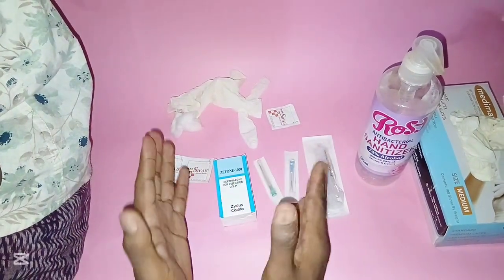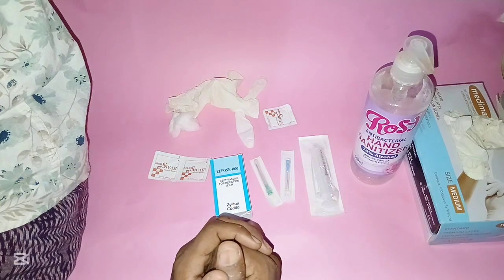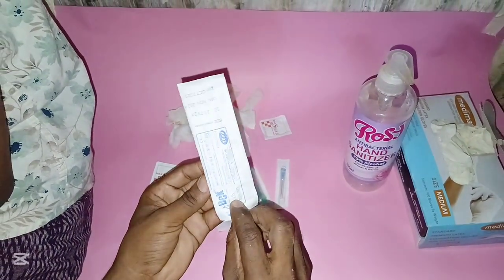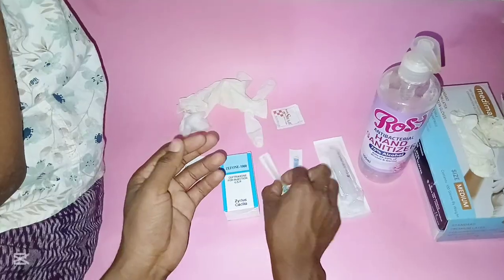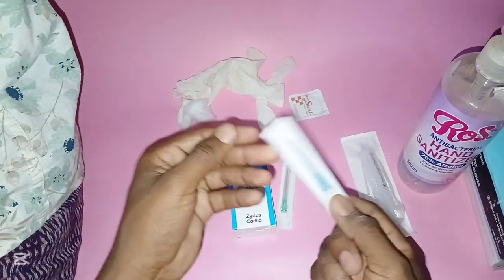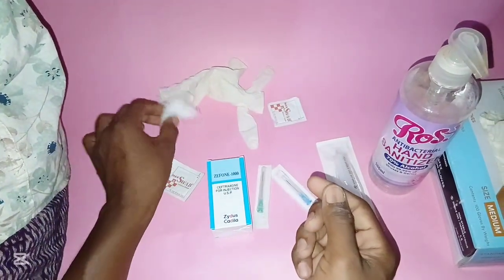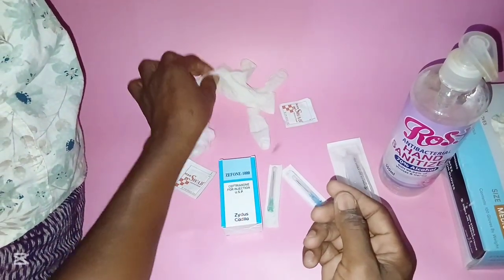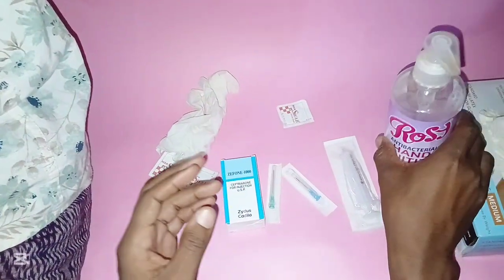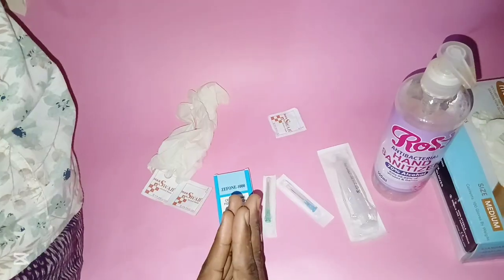Before you start, make sure you gather all the necessary supplies that you need to perform the procedure. For instance, you will need a 10 ml syringe, a 21 gauge needle or a 23 gauge needle, alcohol swabs, cotton wool, gloves, and a hand sanitizer.